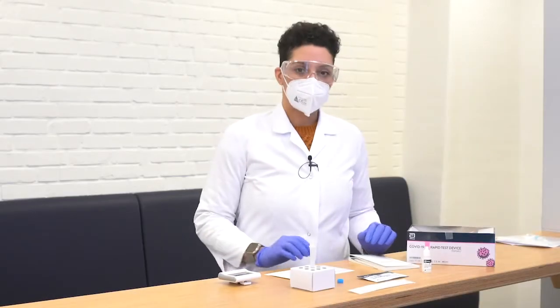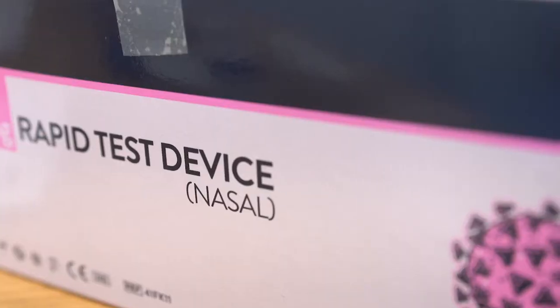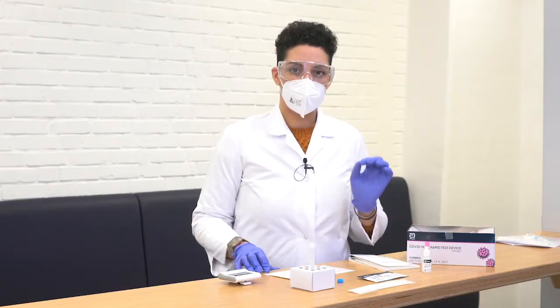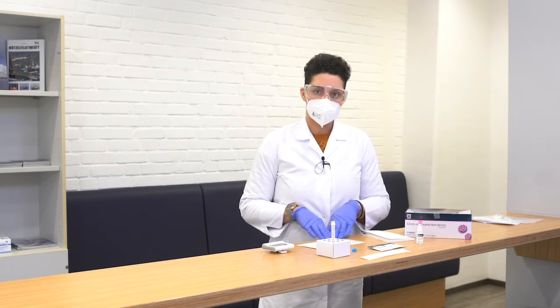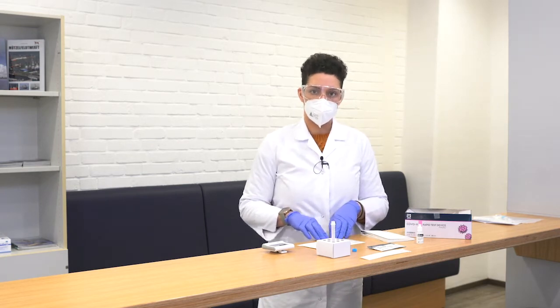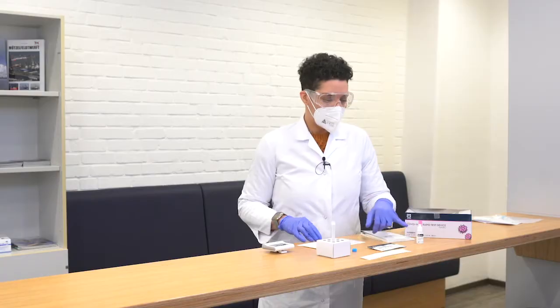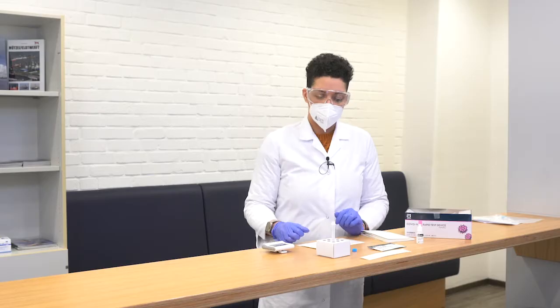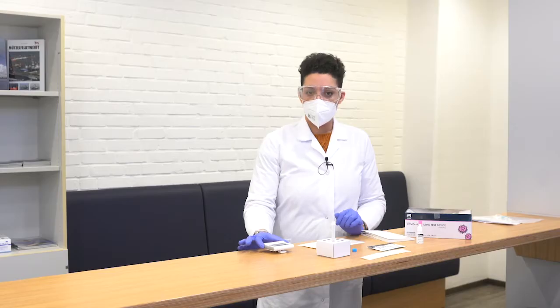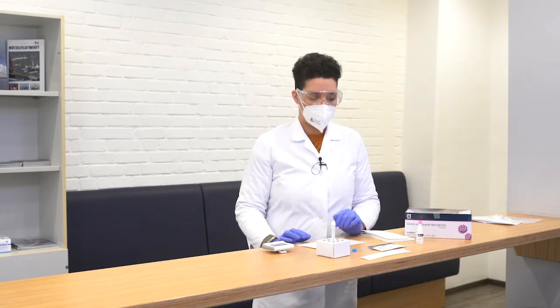Okay. So within the box, it's very important, first of all, that you check that on the box it says nasal. So that means those are the tests that only require for the swab to be entered in the front of the nostril. Within the box there comes the instruction book in different languages, instruction papers that show you exactly the way that you're going to have to do the test. Then we have the test itself. We have the buffer, the swab. We have 25 tubes, and we also need a watch, a clock. So you have to go and get it yourself because it's not within the box.